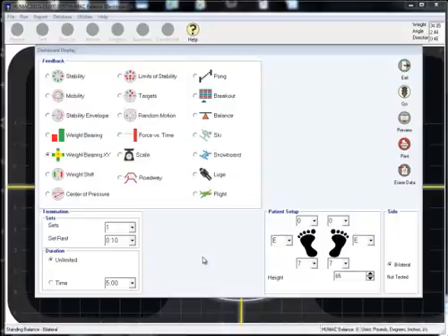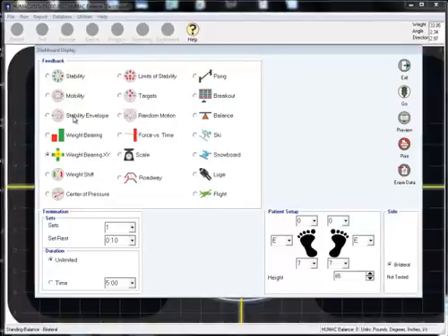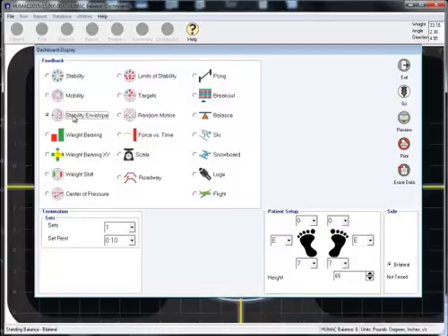The Humac Balance System includes all the popular balance tests such as Limits of Stability and CTSIB. One test that the Humac Balance System has is Stability Envelope, which is a nice way to map the patient's ability to lean, which is an indication of their strength and their neuromuscular control and their range of motion. Select Stability Envelope. Go.